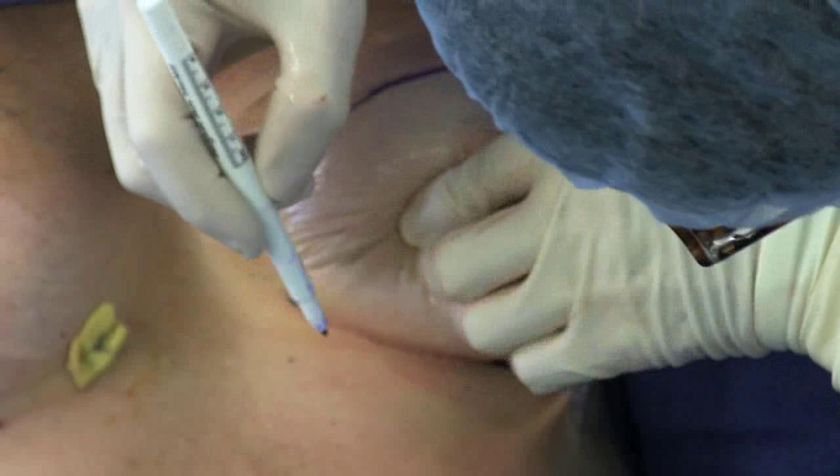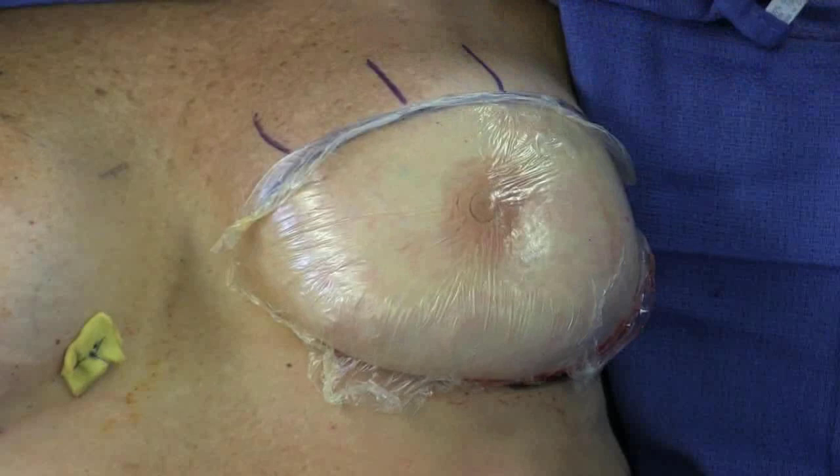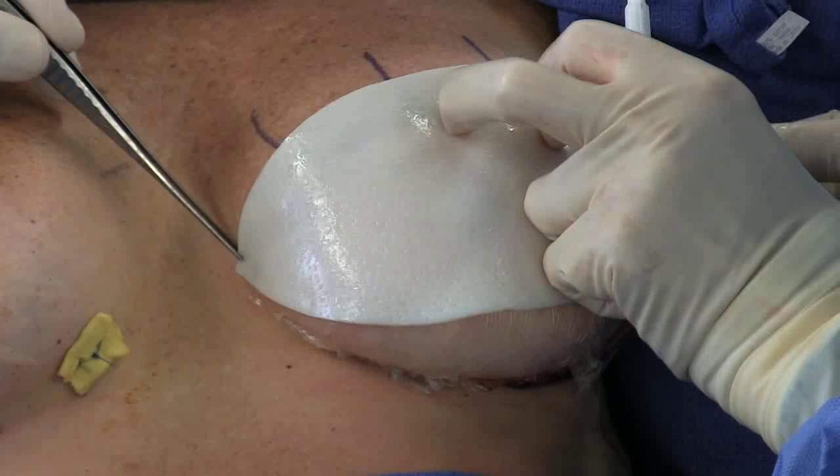The suture locations are then marked along the inframammary crease and along the pectoralis muscle. The acellular dermal matrix tissue, or ADM, is then secured to the skin.